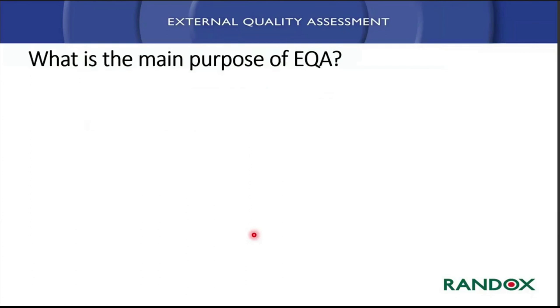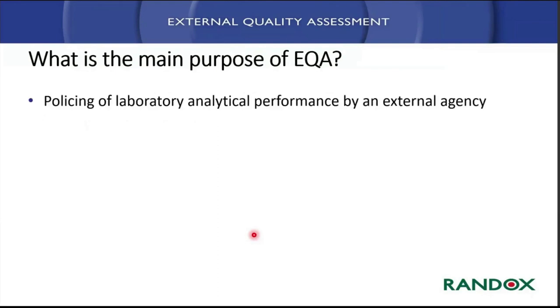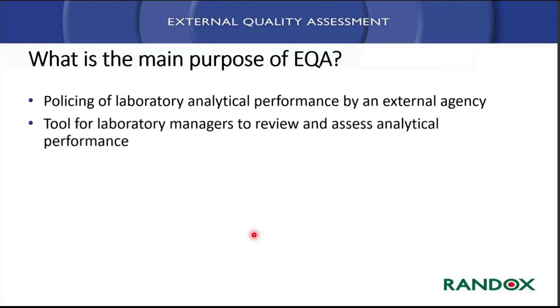I think really one of the issues is, what is the main purpose of the scheme? If you're only doing it for looking at an external agency in order to have a pass mark, then really you're not fully engaging in all the various aspects that EQA can provide. It's really there as a tool for laboratory managers to review and assess your analytical performance, and that's the important aspect. It's more than just having a pass. It's in order to improve your overall performance, to reduce your errors and provide confidence, not only for you, but also for your clinicians who are working on the results that you're providing.